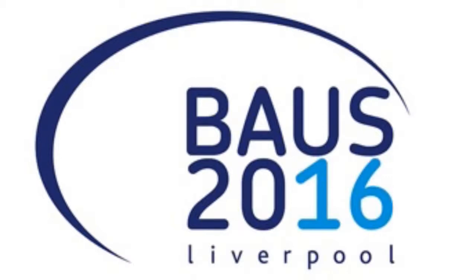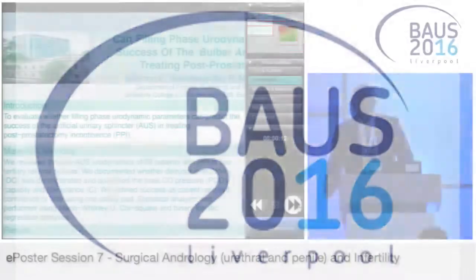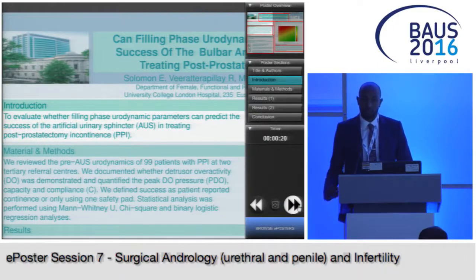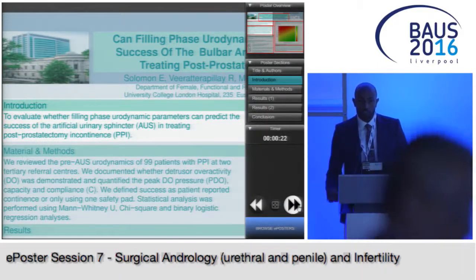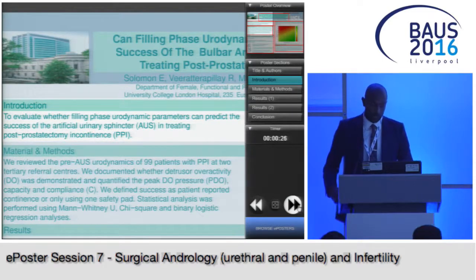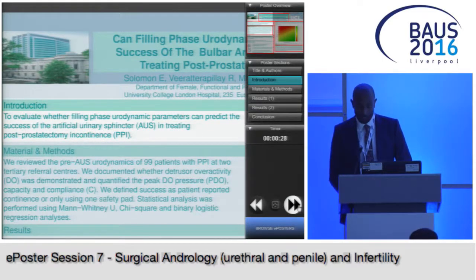Good afternoon all. Thank you very much for the opportunity to present our work. The reported success rate of the artificial urinary sphincter in the literature in terms of treating post-prostatectomy incontinence ranges from about 50 to 70%. So the aim of our study was to assess whether filling phase urodynamic parameters can predict the success of the AUS in treating this patient population group.